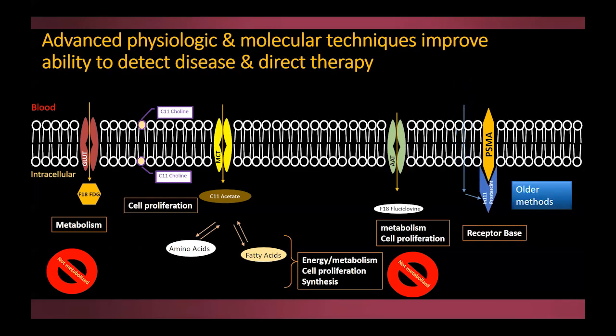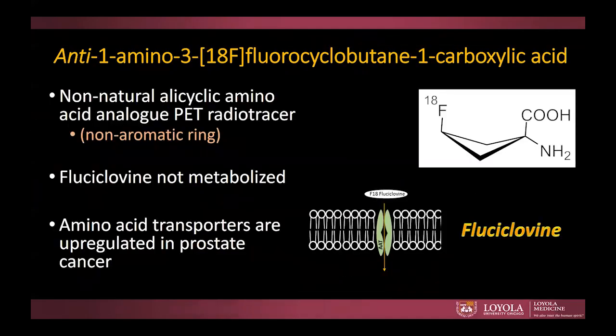Prostate-specific membrane antigen, the older method, was designed to attach to the intracellular binding site, and it's not widely used because it is a very long and hard process for the molecule to go into the cell to do that. The newer method will be to target extracellular binding site on the PSMA protein, and we'll discuss that today.